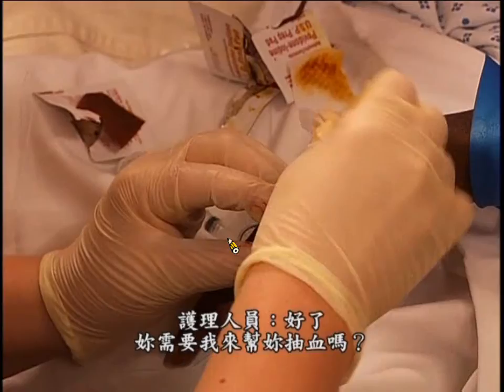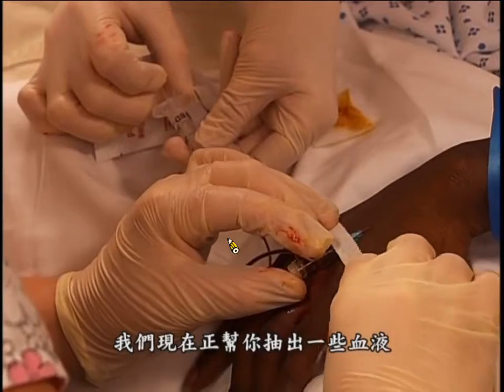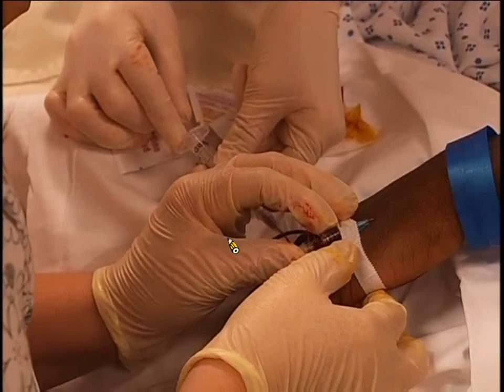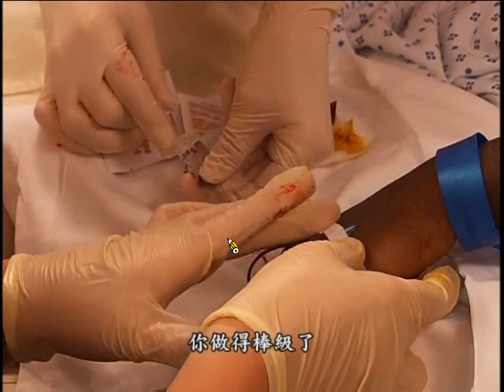There you go. Would you like me to pull back? Sure. Okay. We're just taking a little bit of blood. We're going to send that blood to the lab. You did really good.